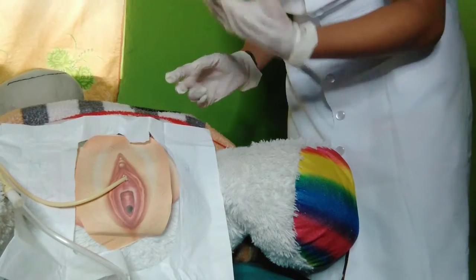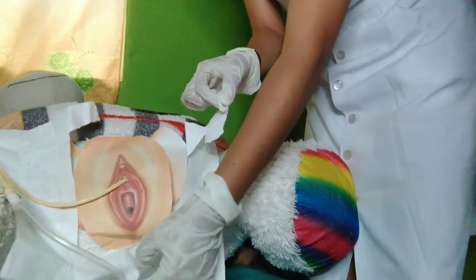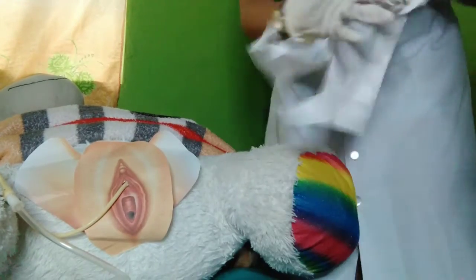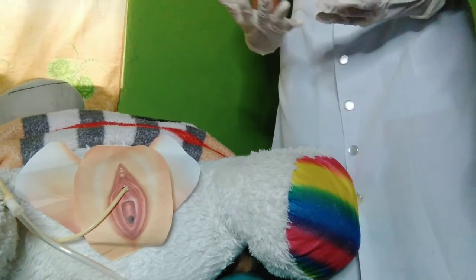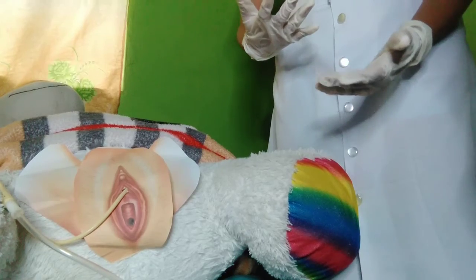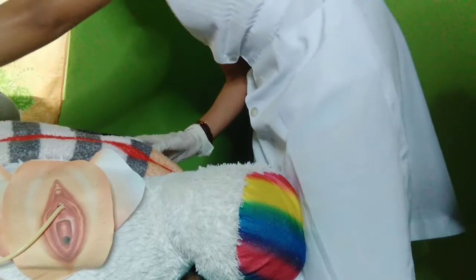Last, I will remove the sterile drape. Dispose of supplies following agency policy. This reduces the transmission of microorganisms. After that, I will cover my patient. And lastly, I will remove my sterile gloves and perform hand hygiene.